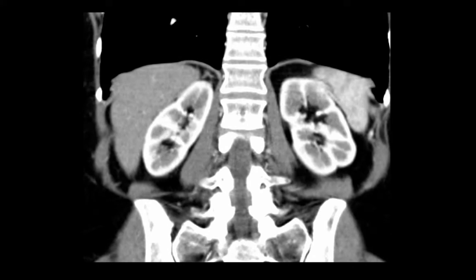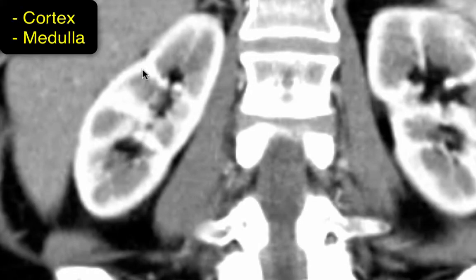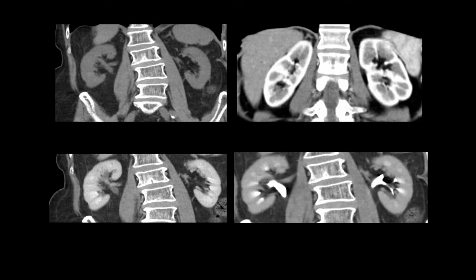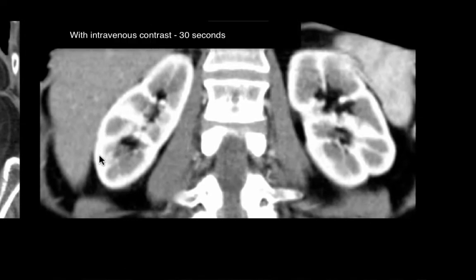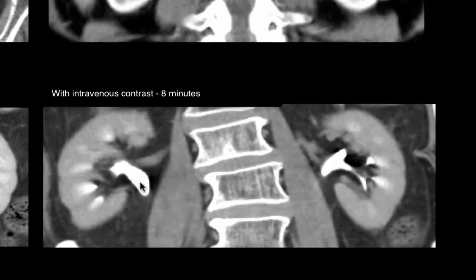The internal architecture of the kidneys has two main components: the outer cortex and the inner medulla. The cortex has parenchymal bands that extend to the medial aspect of the kidneys, dividing the medulla into triangular-shaped pyramids. Without intravenous contrast the kidney appears uniform, but with contrast the outer cortex enhances earlier and is much brighter than the medulla at about 30 seconds. At about 90 seconds, there is more homogeneous opacification of the cortex and medulla. At about 8 minutes, contrast can be seen excreting through the ureters and collecting system, which now appear bright.